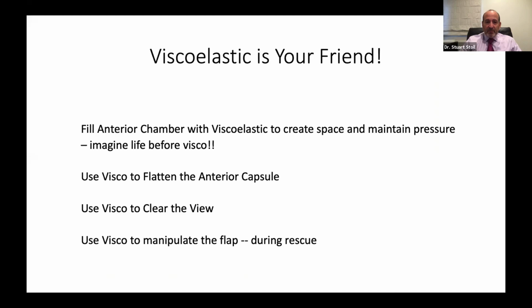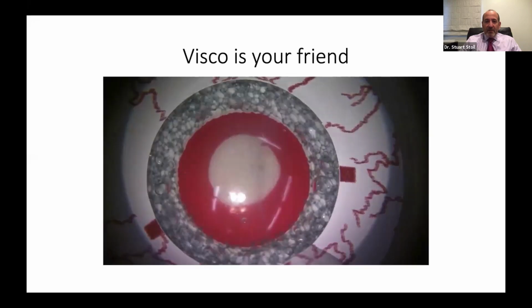With such a tremendous benefit we have. We can flatten the anterior capsule, we can clear the view, we can manipulate the flap. Viscoelastic is certainly your friend.